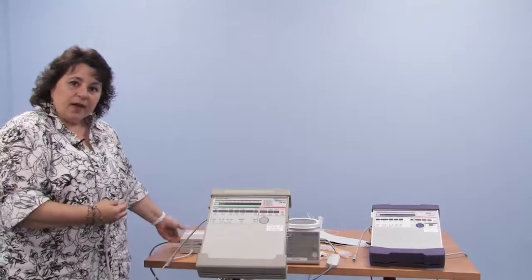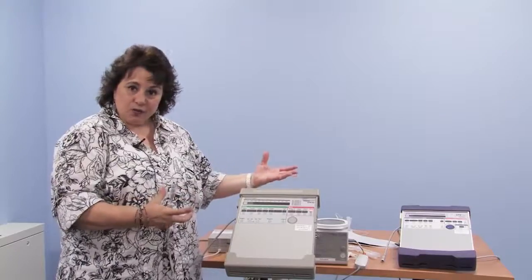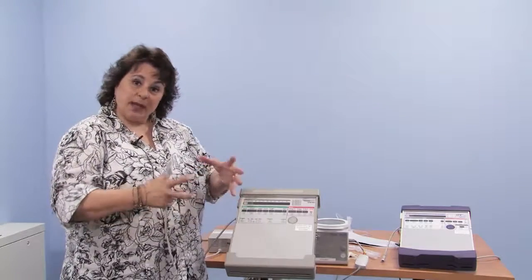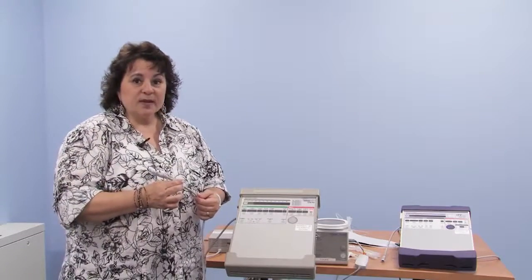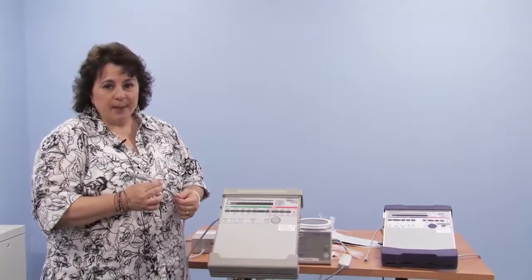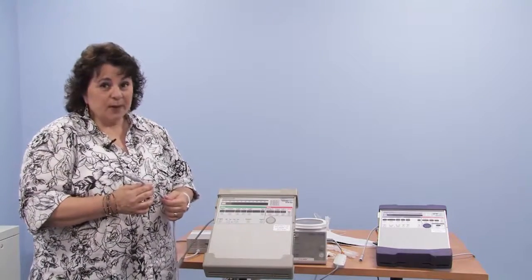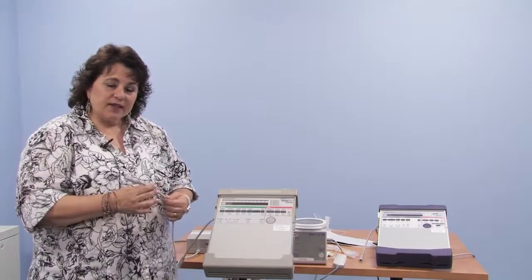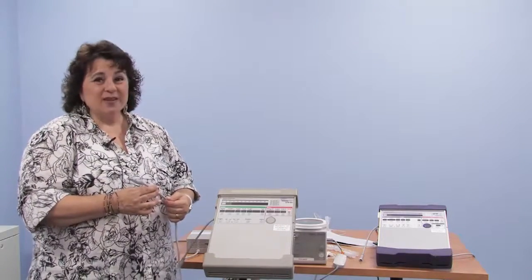In addition, the Durable Medical Equipment Company, or DME company, which provides you with this equipment in your home for your child, will provide you with a car type battery that's in a plastic case that also has an adapter like this to go to the ventilator. It's recommended that once a month you run your child's ventilator on that battery to assure it's charged fully and how much charge it holds. It should be about 8 hours. It does depend on how much draw from the child's settings on the ventilator, but it should be about an 8-hour battery. You don't want to wait till the middle of a winter storm to find out that it's not working.